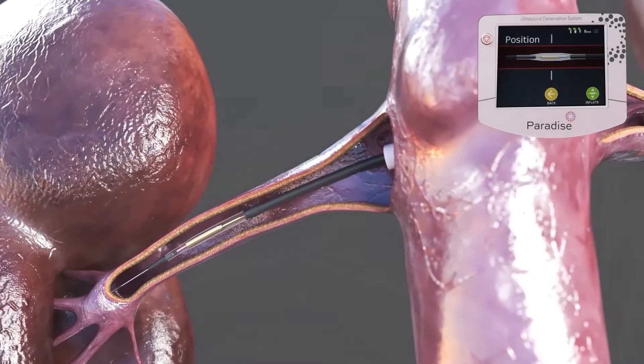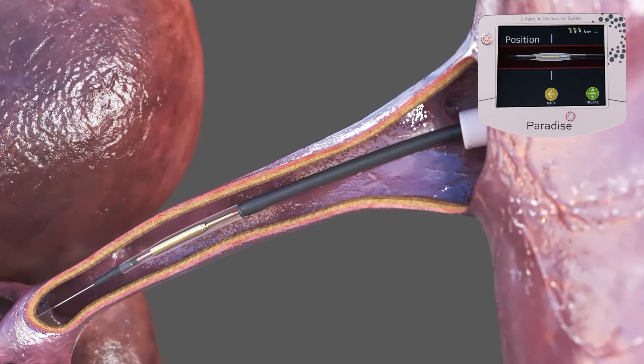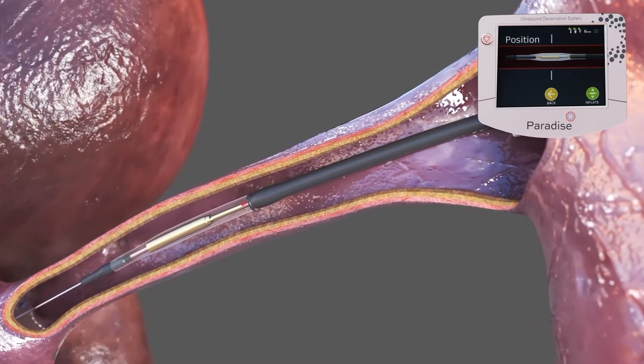The Paradise catheter is advanced over a standard guide wire and through a renal guiding catheter into the distal end of the main renal artery proximal to the distal branches.